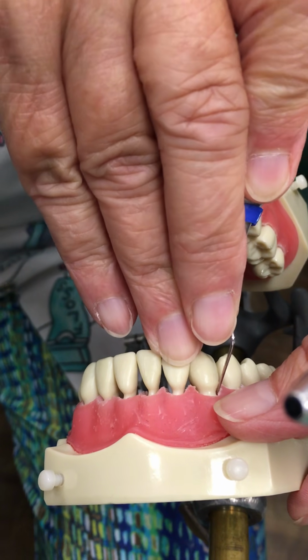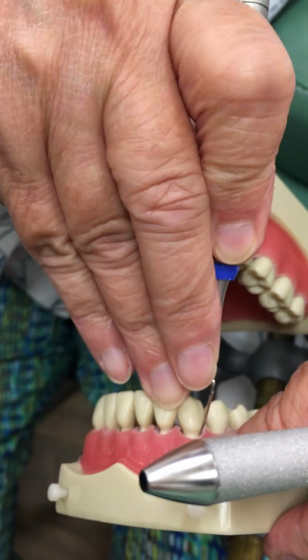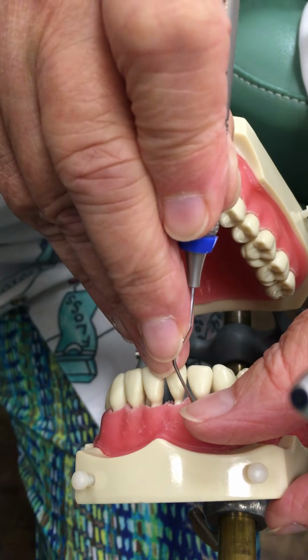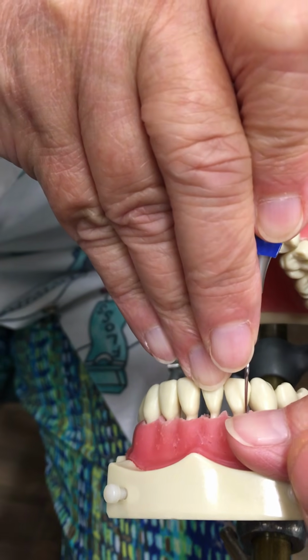And as I go around the corner, I'm going to lean my hand in that direction. And I've got my head tilted some so I can see. And I'm going to back up my fulcrum. And remember, fulcrum always needs to be as close to the working area as possible.